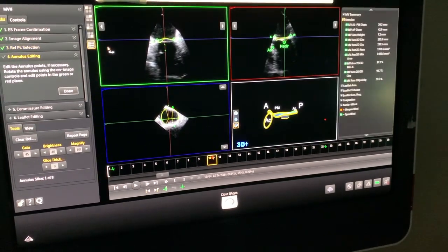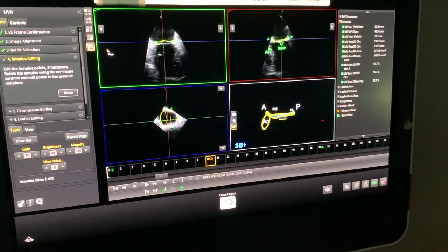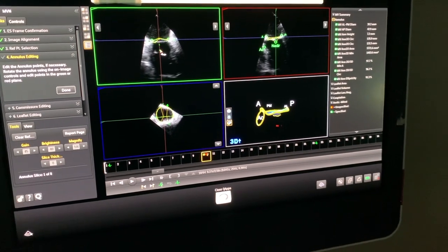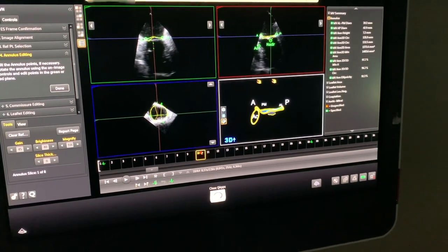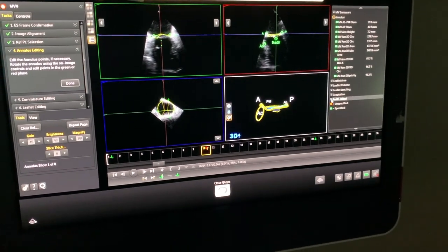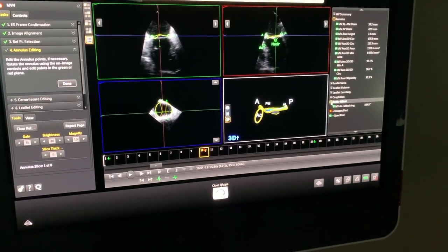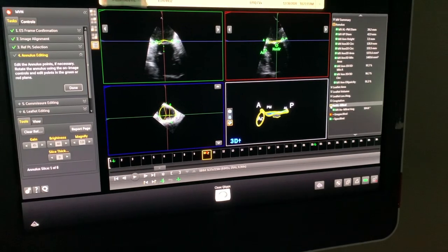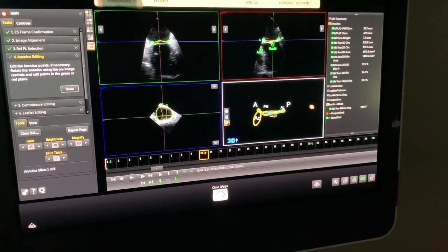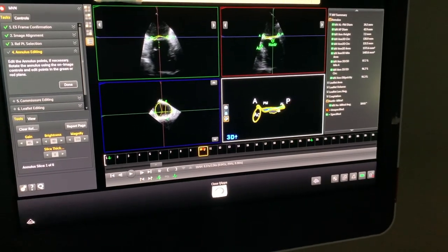All the processing is done for you. You click on the tab that says aorta-mitral angle, and it's listed right under.